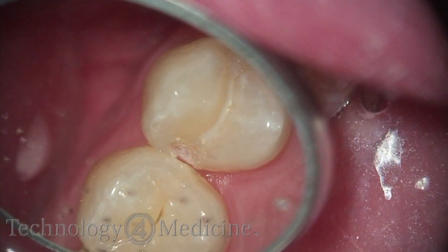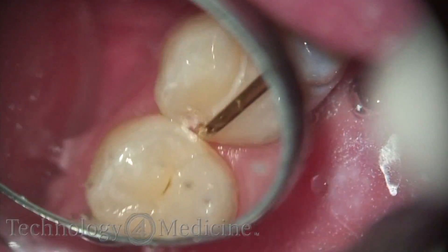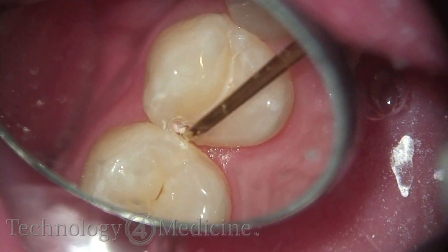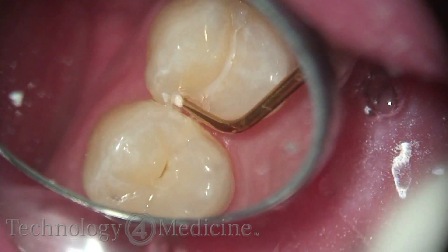Once you get to a certain point in the bottom of the box, I'll change the laser settings and go back in to clean the rest of the box up. I'll use a spoon excavator to remove any remaining decalcified tooth structure and decay that might be present.